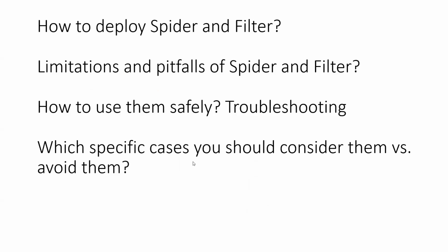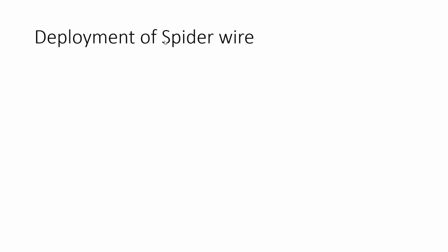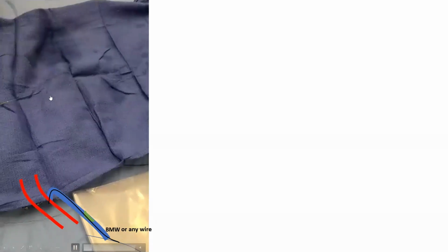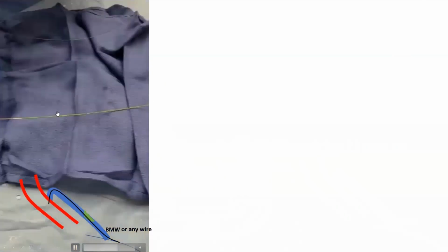I will explain now how to deploy the spider and filter wire, the technical steps. So I will start with the more important one, which is the spider wire. The first step in deploying spider wire is actually to wire your graft with your wire of choice. You can use a BMW or any workhorse wire, or in difficult cases, you can use a polymer wire like a whisper wire. Then after that, you take the spider wire out of your container, and this is how it comes. It's a basket, and there's a catheter behind it, the green catheter.